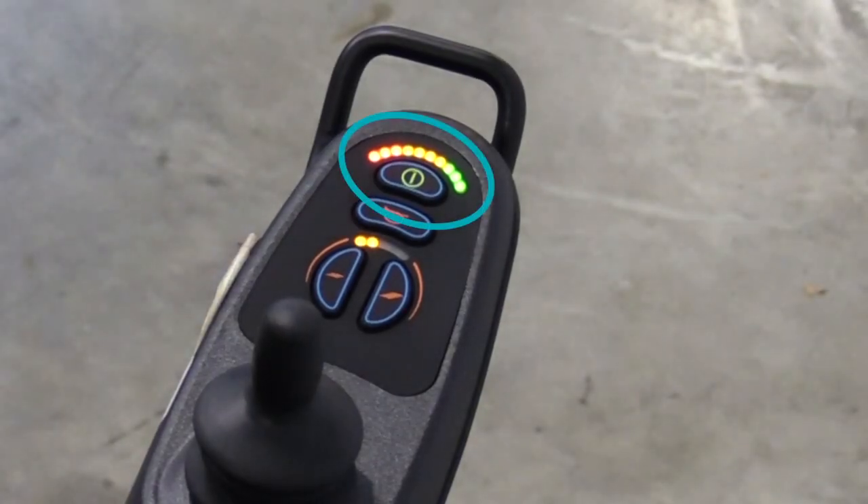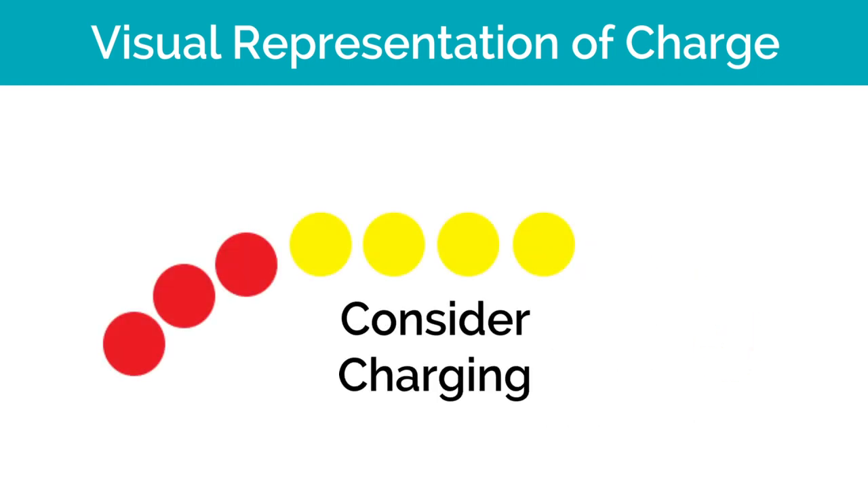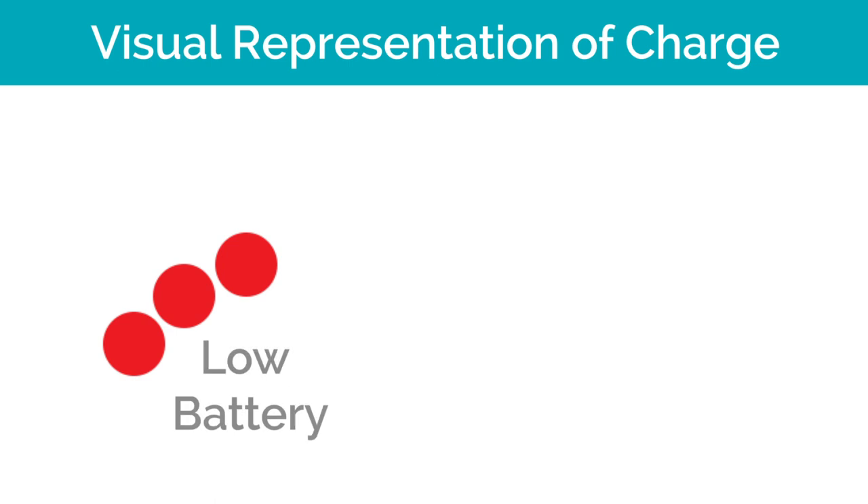It is important to keep an eye on your battery indicator as it is a visual representation of your charge. On green, your battery is well charged. On yellow, start considering charging. On red, you have low battery and will need to charge your Puzzle.